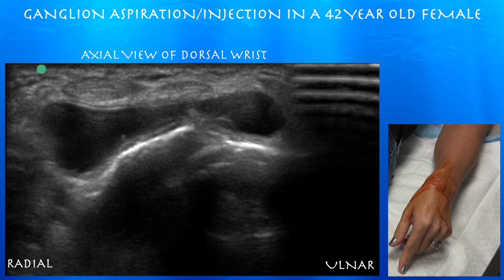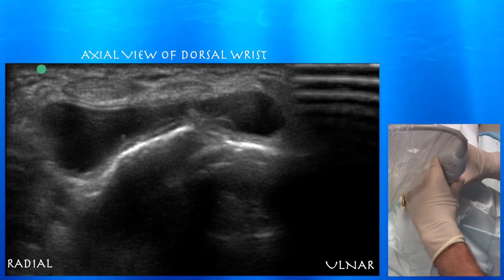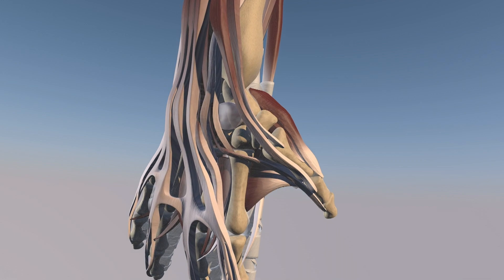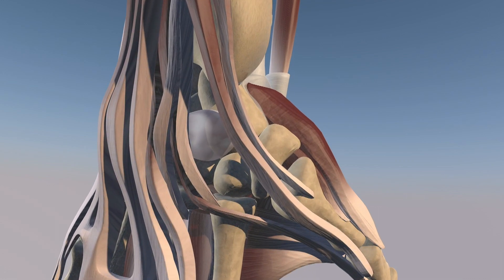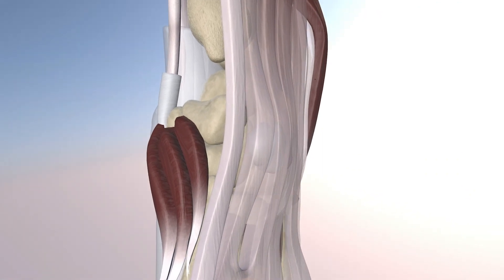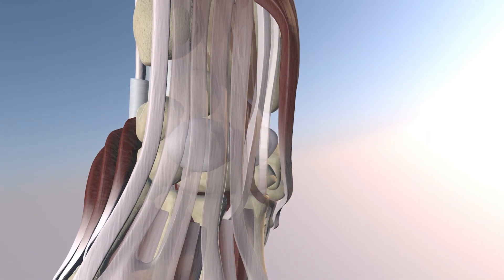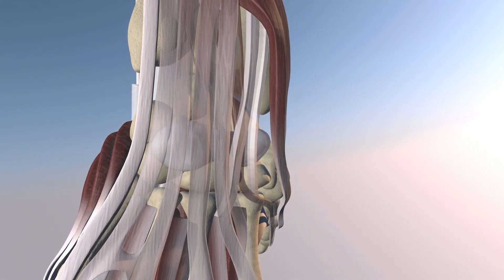We're going to look at it from the ultrasound. It looks like it's two cysts, so we might have to drain it twice — but actually it's one cyst. Here's this pretty sizable ganglion on the dorsal aspect of the wrist, going in a transverse direction across the scaphoid and lunate. You can see how it's making the extensor tendons bowed up from the size of the cyst, and it will make the extensor tendons appear translucent.